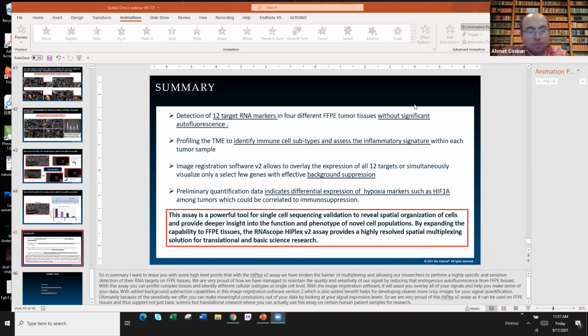Yeah, and along those lines, when you compare the assays, the rigorous comparisons of fluorescence version 1, 2, HiPlex, do you guys have any quantification framework? Because when you mention, oh, this works, this is better, I'm curious if there is any plot that shows the number of transcripts for the same sample. Because when you do these kinds of assessments, I think it will help scientists to find their own appropriate assays. Correct. Show the quantification for the comparison. Yep, that will be very helpful.